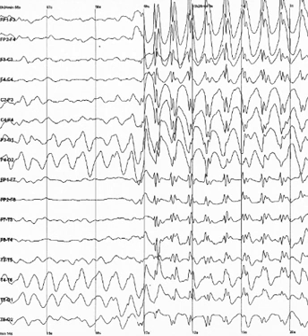In addition to the posterior basic rhythm, there are other normal alpha rhythms such as the mu rhythm, alpha activity in the contralateral sensory and motor cortical areas, that emerges when the hands and arms are idle, and the third rhythm, alpha activity in the temporal or frontal lobes. Alpha can be abnormal, for example, an EEG that has diffuse alpha occurring in coma and is not responsive to external stimuli is referred to as alpha coma.